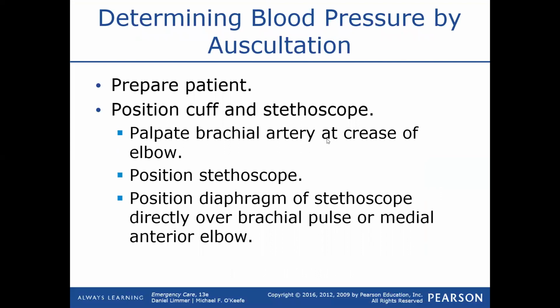Okay, prepare the patient. Just let them know, hey, we're going to squeeze your arm. Okay, and it's also actually very appropriate for us to say, is it okay to take a blood pressure on this arm? Women who have had a mastectomy and people who are on dialysis, they can't take a blood pressure on that side of that arm. And these patients know. They know that they can't do it on that arm.